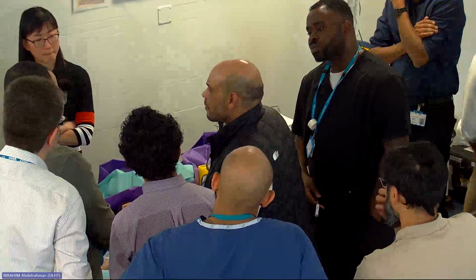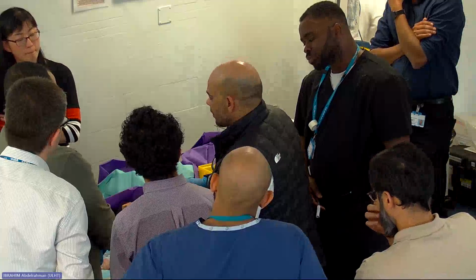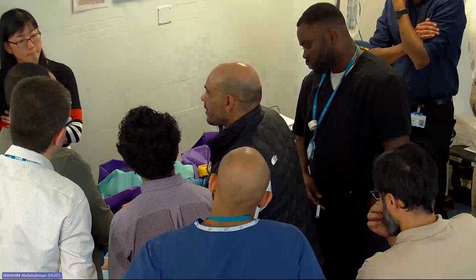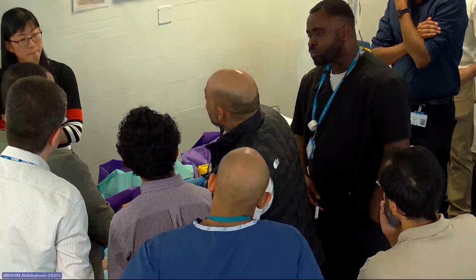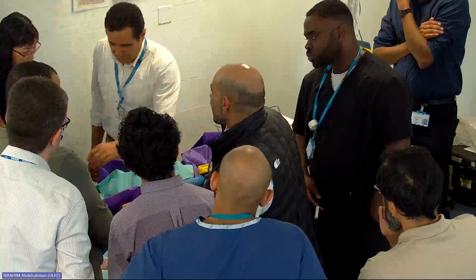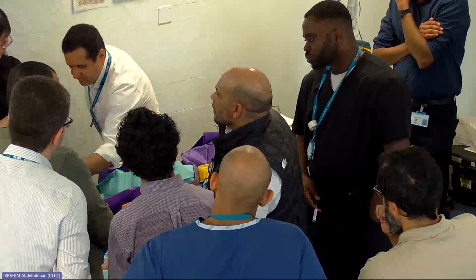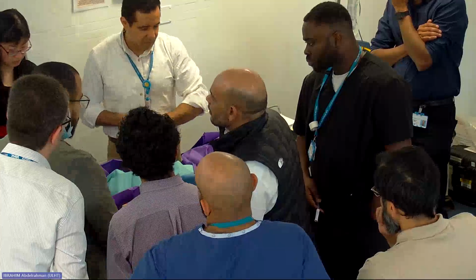I can go to the debrider, which you can see tissue removed. There is a version that is more powerful, which has irrigation. So it gives you irrigation. Normally, I will put the local anesthesia in the turbinate or saline inside the turbinate, so this can work better. It has its own irrigation, which would remove more tissue.